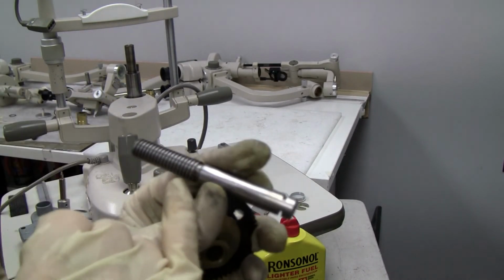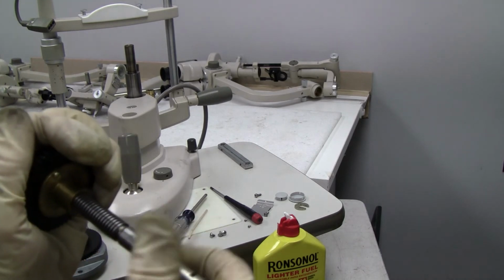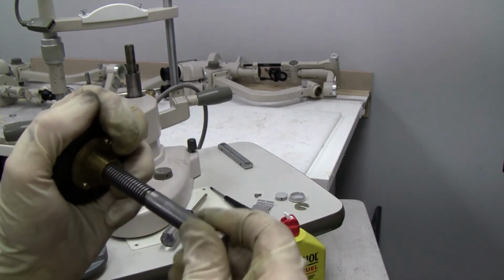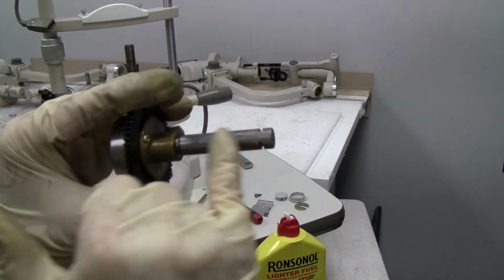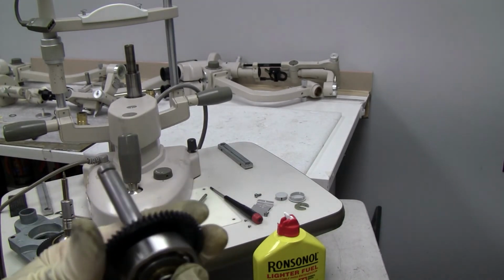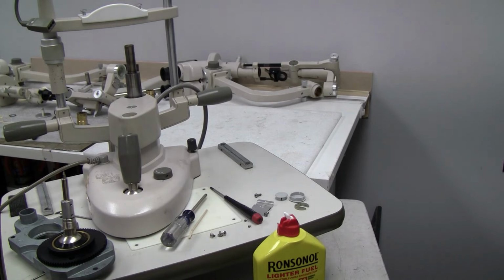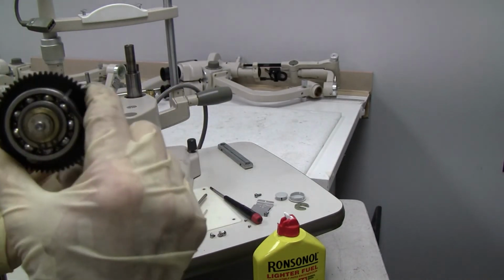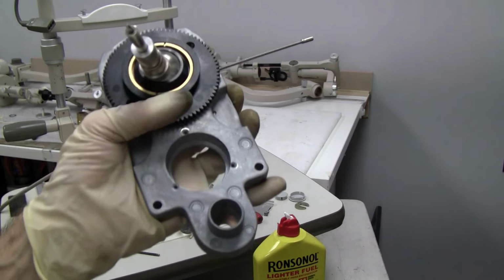See, the threads are so thin, and so a little grease in there that gets old, it makes it hard to turn. So after you've re-lubed that with some grease and a little lubricant if you need, re-grease this shaft, put your safety stop washer back on, put it back in.